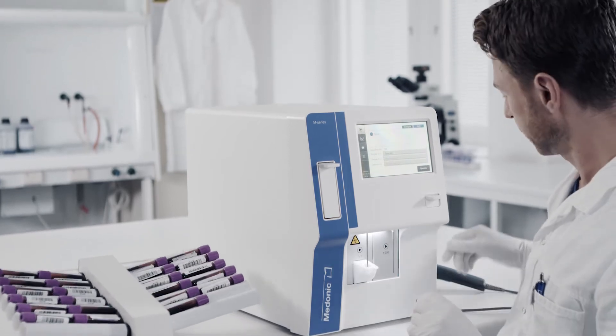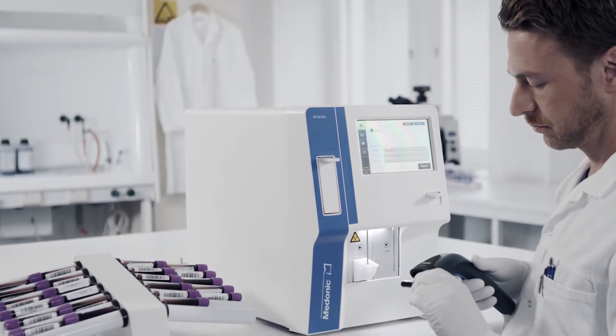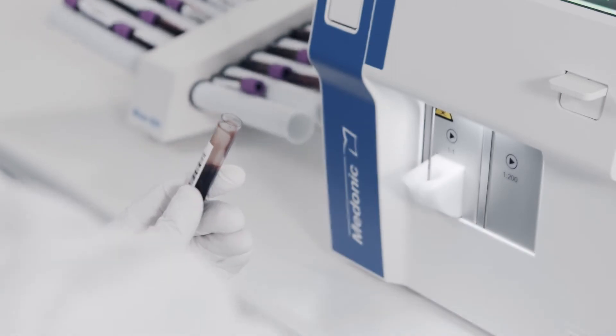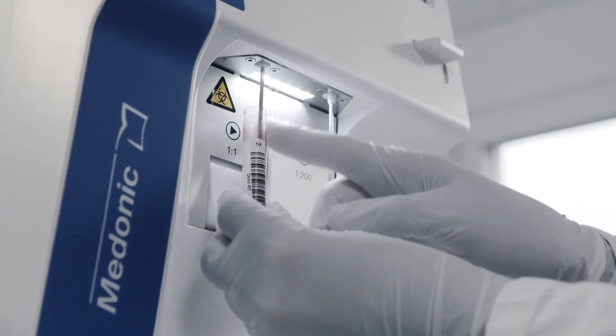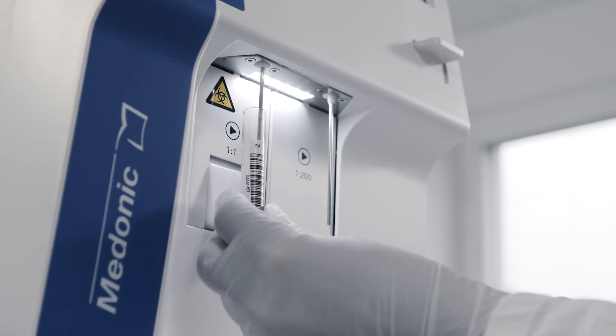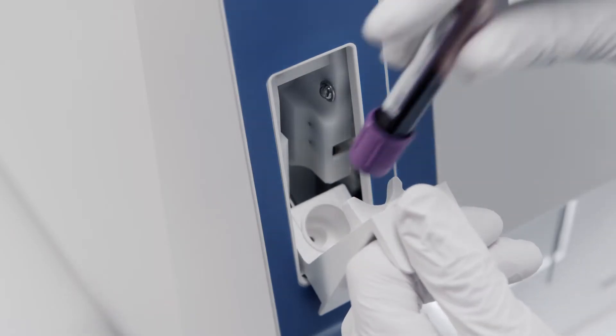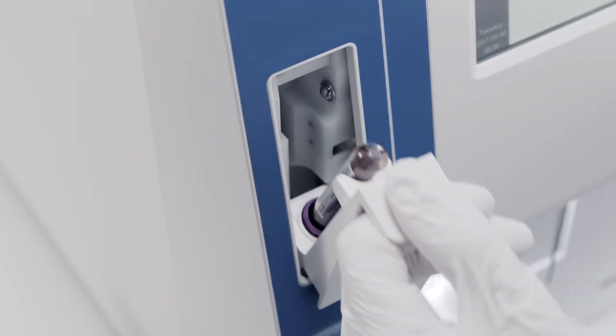With its four different models, Madonic M32 gives you more options than any other unit of its kind. From whole blood, you can sample using the traditional open vial method, or choose the increased safety of closed-tube sampling that our cap-piercer model offers.